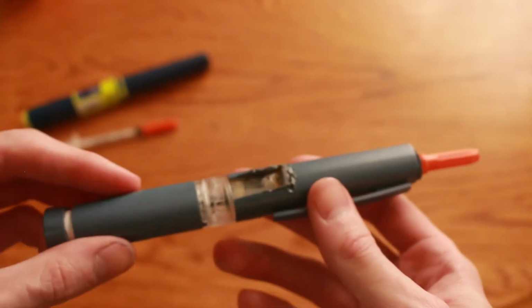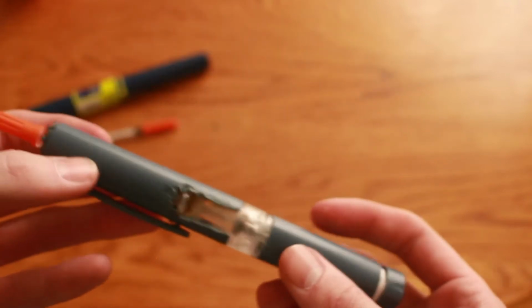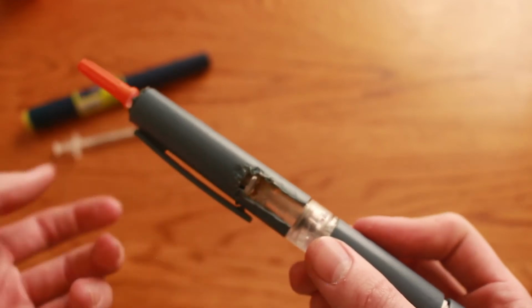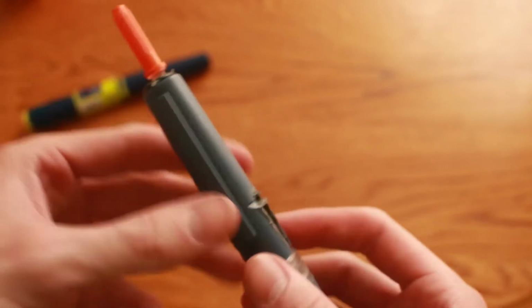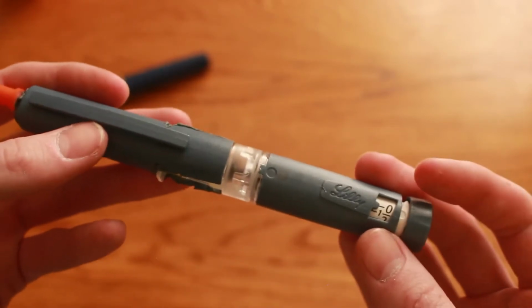This used to be a Humalog Quick Pen from Lilly, and I literally chopped off the plastic end right here about halfway, took out the vial, and managed to replace the vial with an insulin syringe. Now, the reason I use Lilly is for a few reasons.